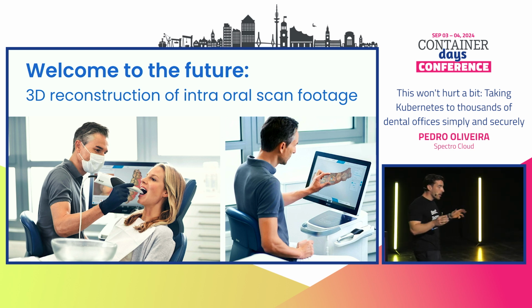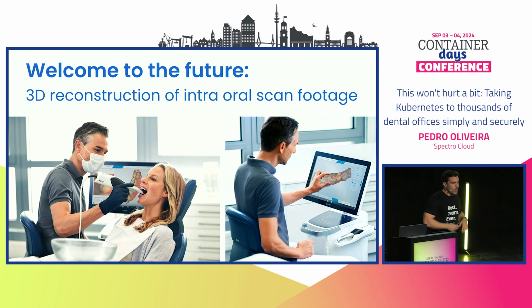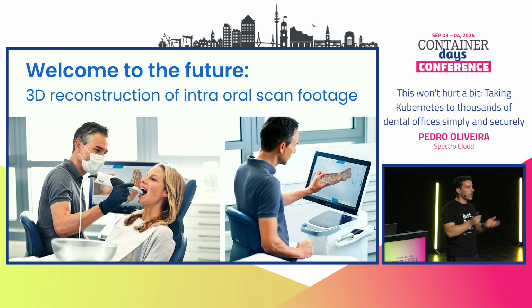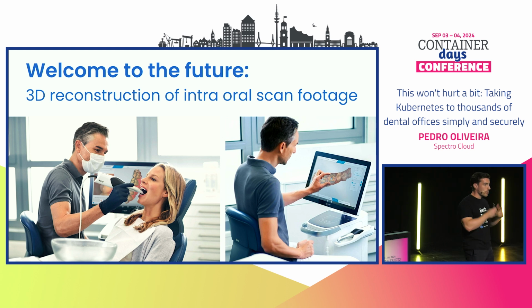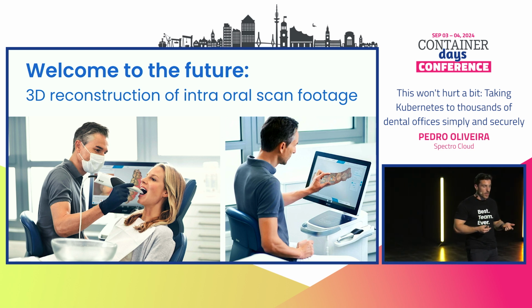So today, what we have effectively is this 3D reconstruction intraoral scan. So basically, the dentist is able to scan your whole mouth, and as they do, they will be able to build your braces or do any checkups and check for problems that you might have in your teeth.